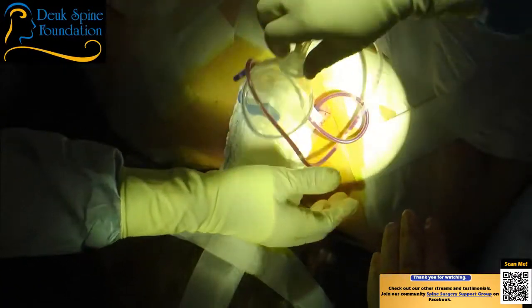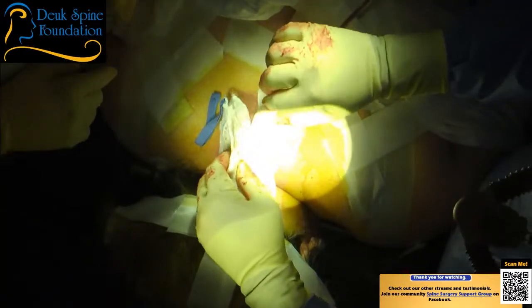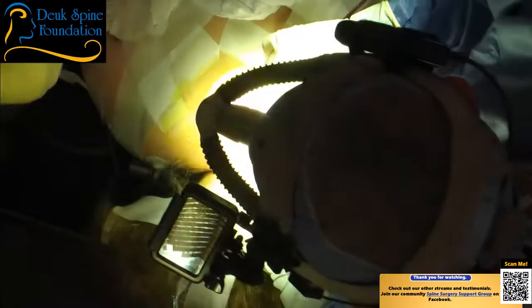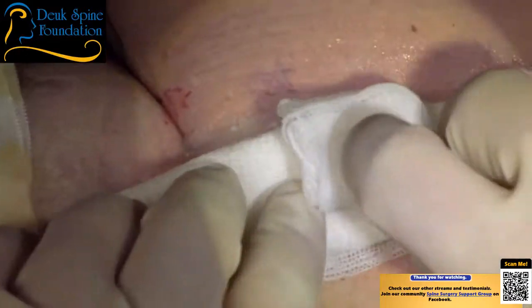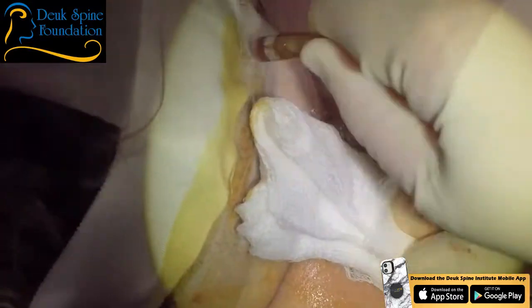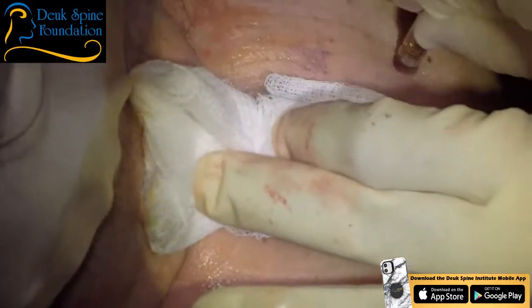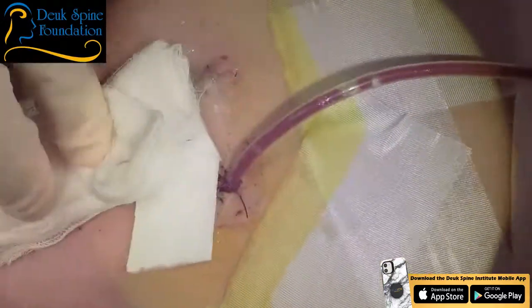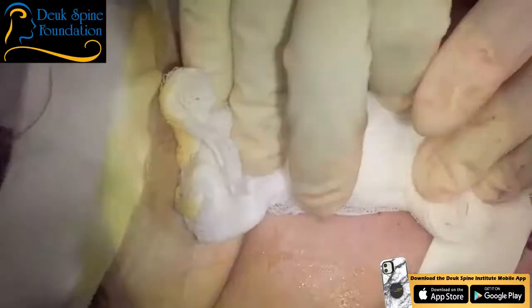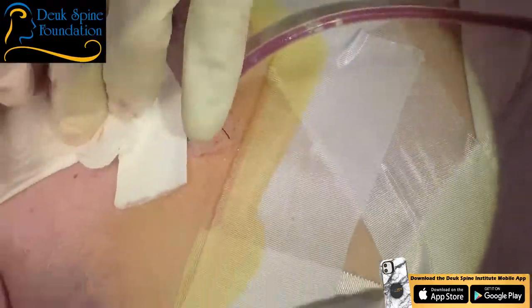All right. Let's get this out. Let's get this off. I need the benzoin and the scissor and the paper tape. Where's my paper tape? 2-inch paper tape. Where's my benzoin, guys? We need probably more than one. We don't have another one? This is what you guys have been using? Do you want a bigger one for these cases? What I want is a little more than this. So two of these, perhaps? That's good. We're good.